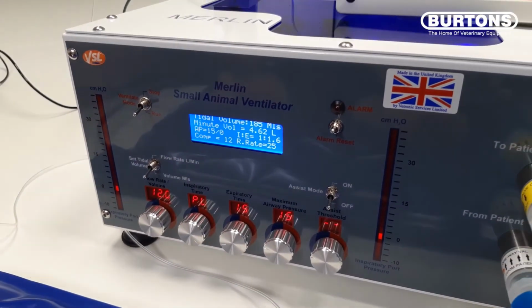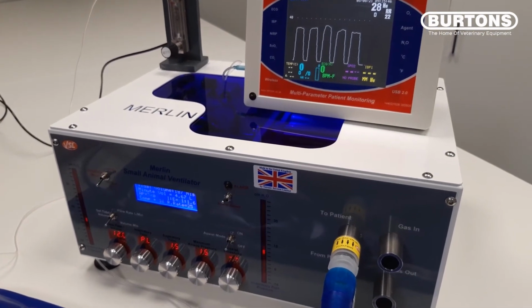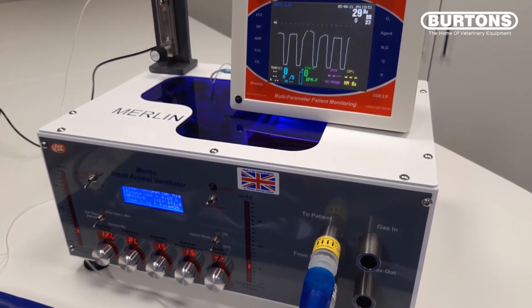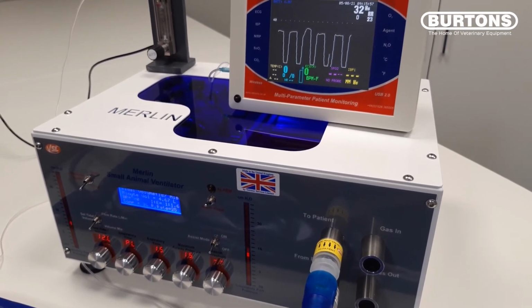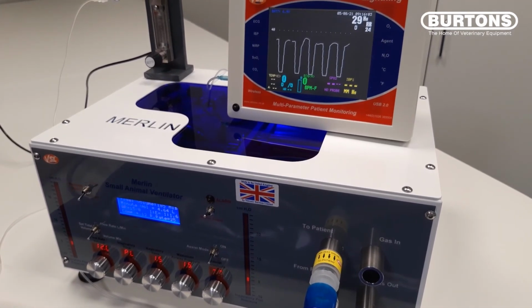4.67, and our end tidal should fall a little more. Now we've fallen down to end tidal of 28, 29. And the process is reproducible. As we continue to increase the respiratory rate, our end tidal value will continue to fall as the minute volume is increased for this animal.